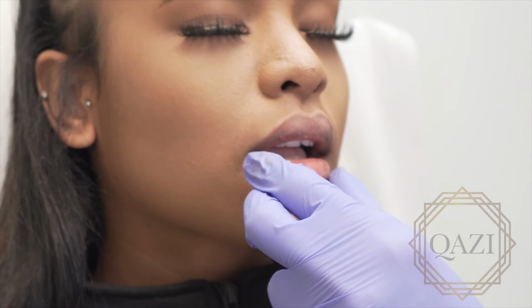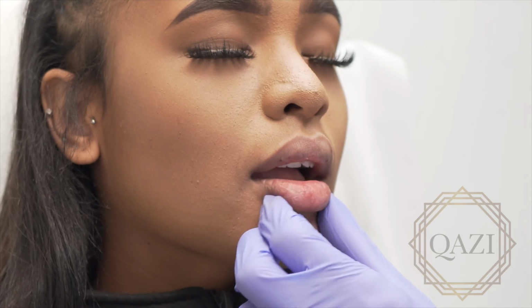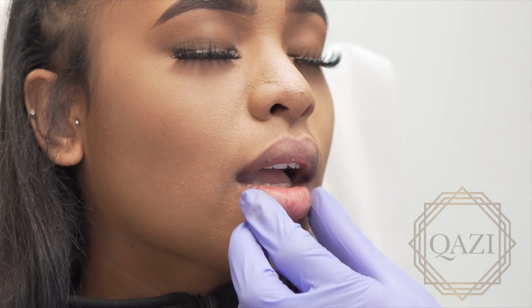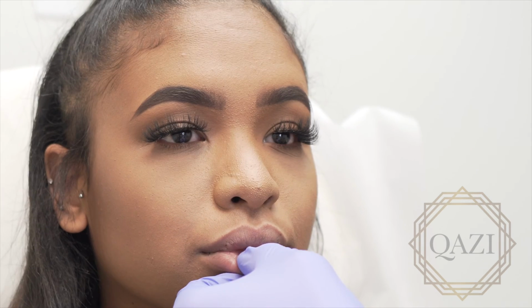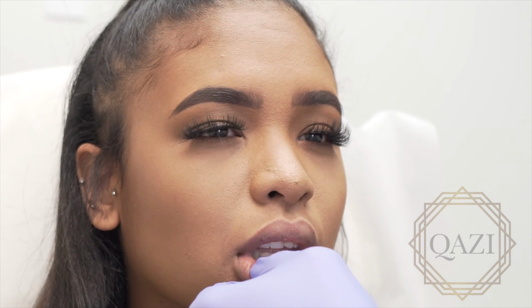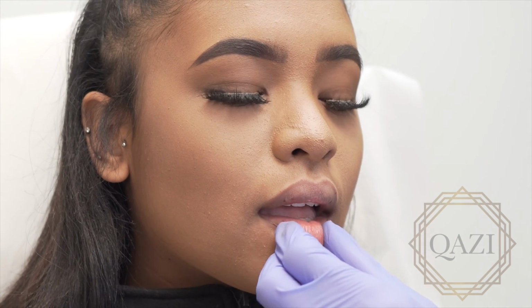And then you want to massage to make sure that there's no lumps or bumps. Obviously, you don't want to do excessive massaging, but this is the time to really ensure that the lips are proportional and balanced. I actually do my massage typically in the shape also that I want the lips to be in at the end.